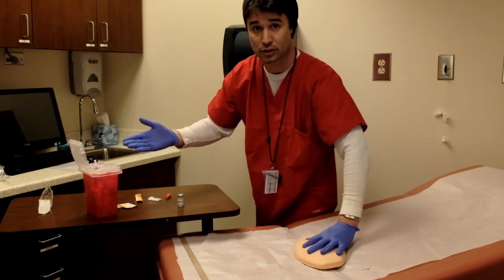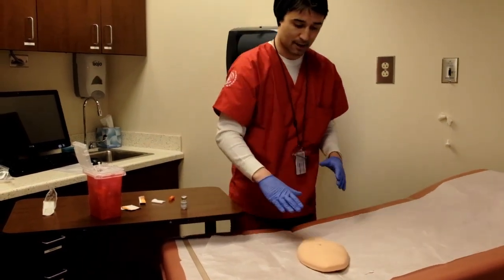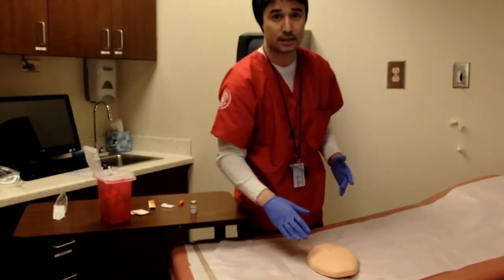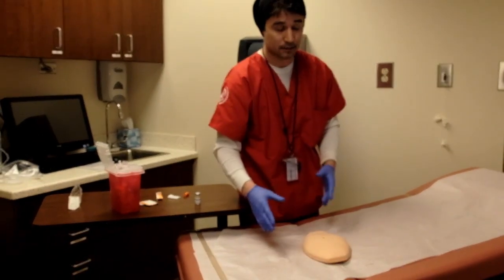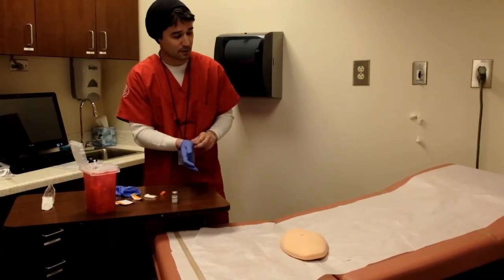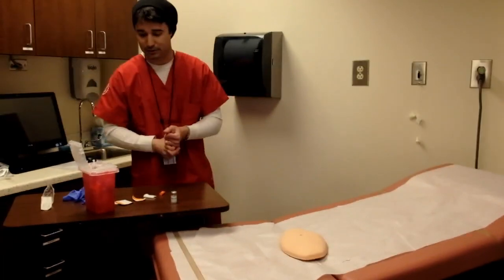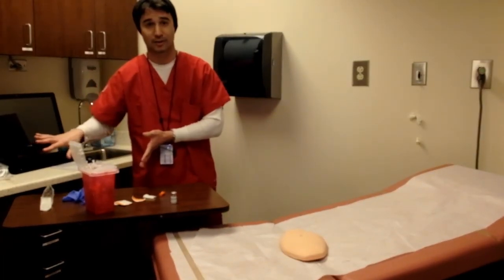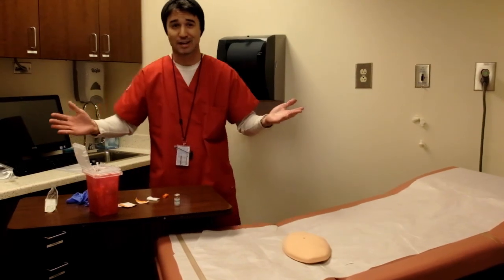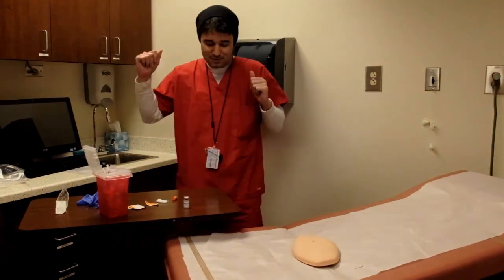dispose of the syringe in the sharps container. If there's any bleeding after you've given the injection, you can give the patient a Band-Aid. And at that point, thank the patient very much for their time, and let them know that we'll be seeing them again soon, and we can finish with the rest of our cleanup. Other than that, that's it. Thank you very much for watching.